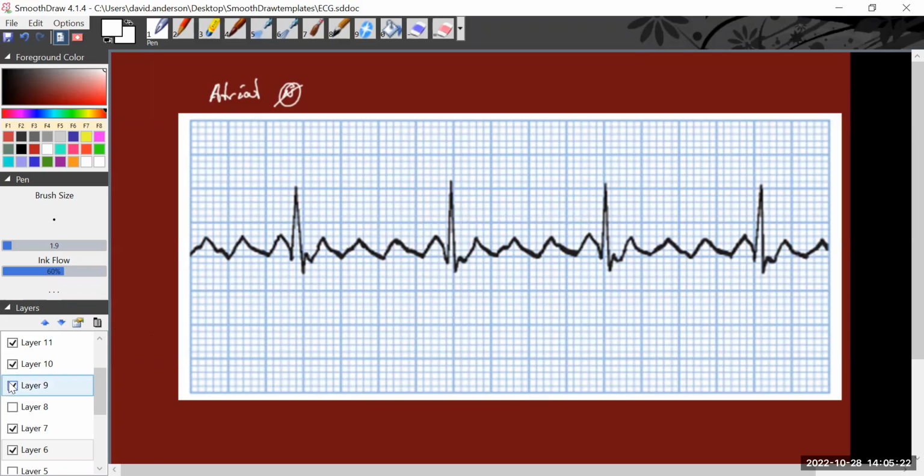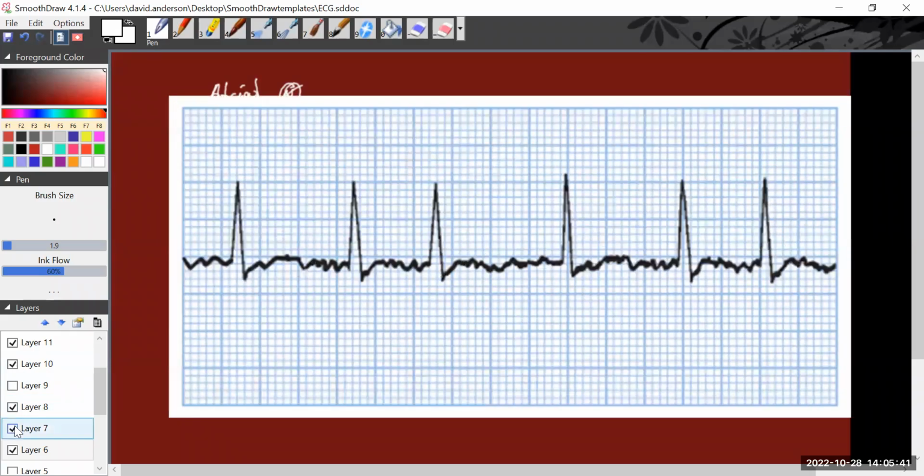Now, if we go to the extreme, and that's basically when we have the atria reproducing contractions even faster than flutter, it's called fibrillation, atrial fibrillation. And atrial fibrillation looks like this. So it starts to look a little messier.